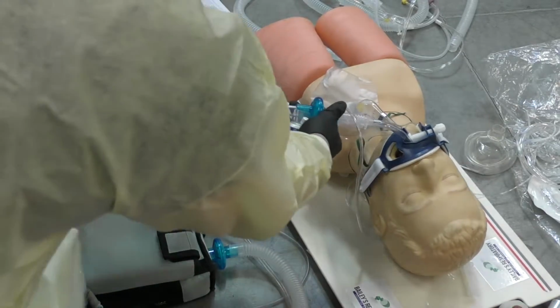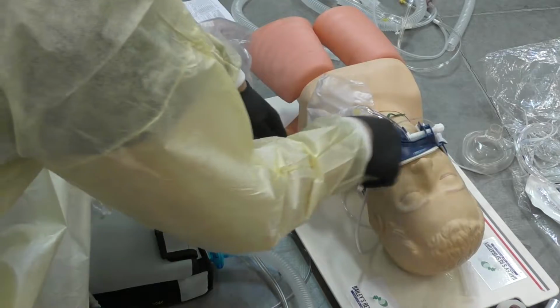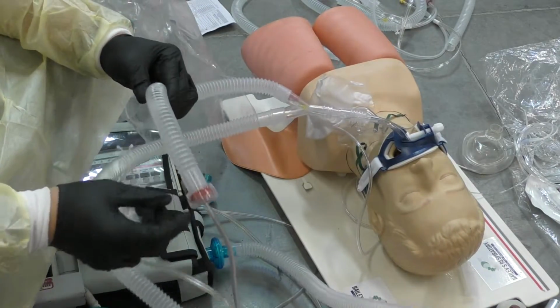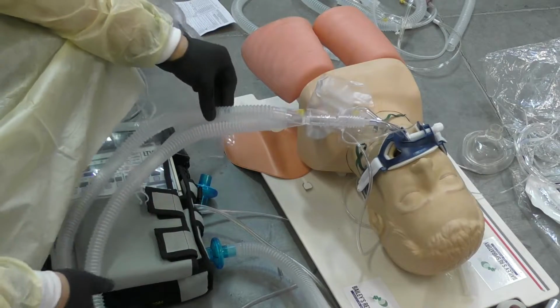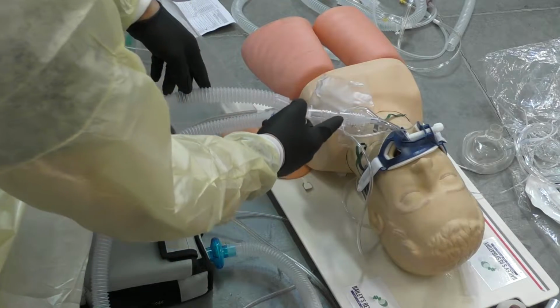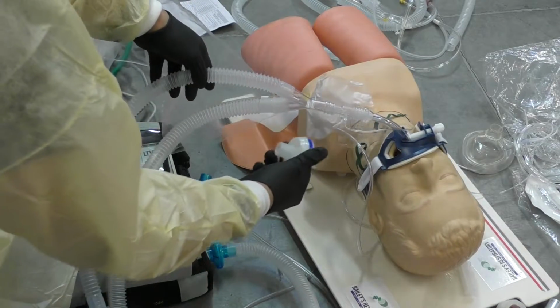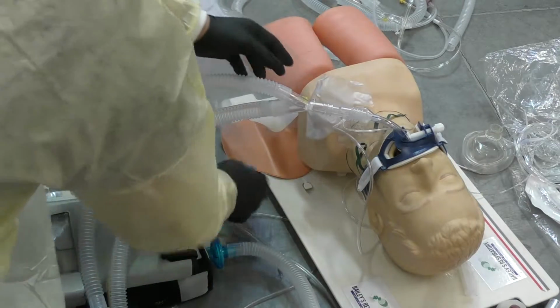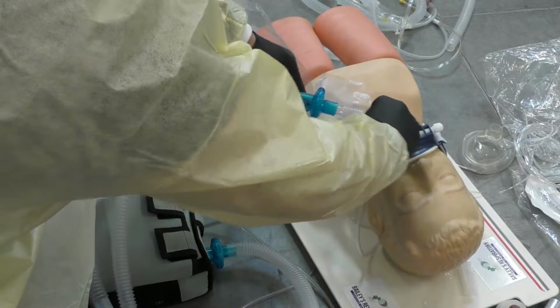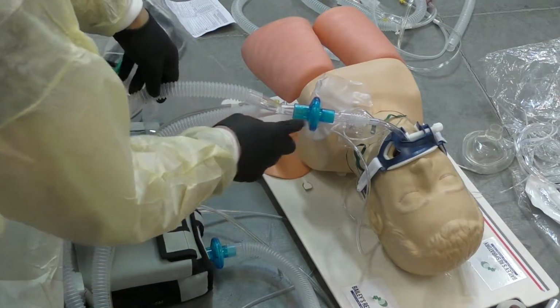If you don't have a barrier here, you're going to be expelling all those droplets out of this. So the only way to protect us from that is you've got to put another filter proximal to the patient, and so we'll put our filter here. And we also have one that protects the machine. Now these are just regular filters.